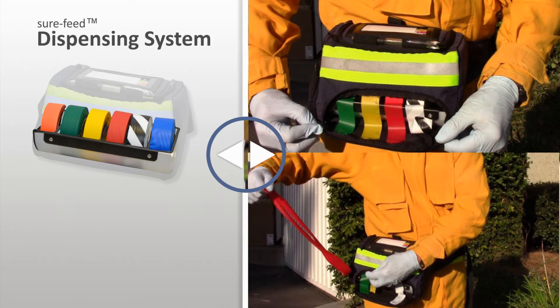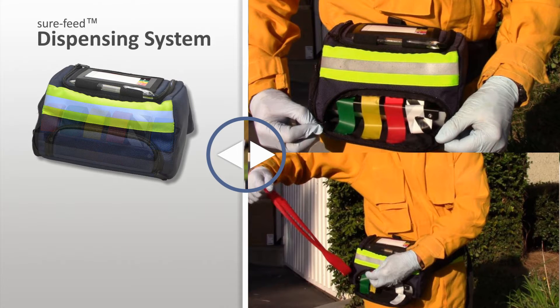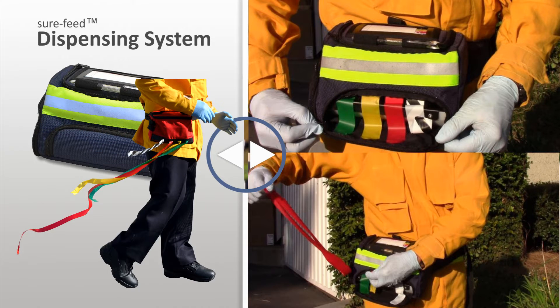The tray can accommodate six ribbons for facilitating marking of contaminated or involved but not injured patients. The bay design eliminates problematic rooster tails common in other designs, and ensures ribbons are always at the ready by eliminating internal tangling and reverse feeding.